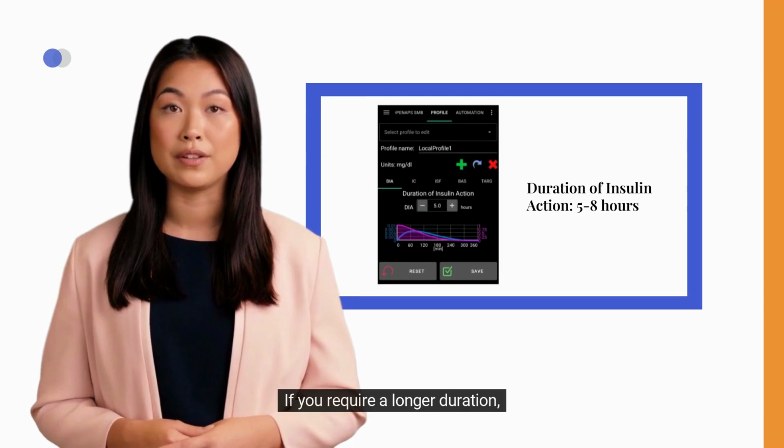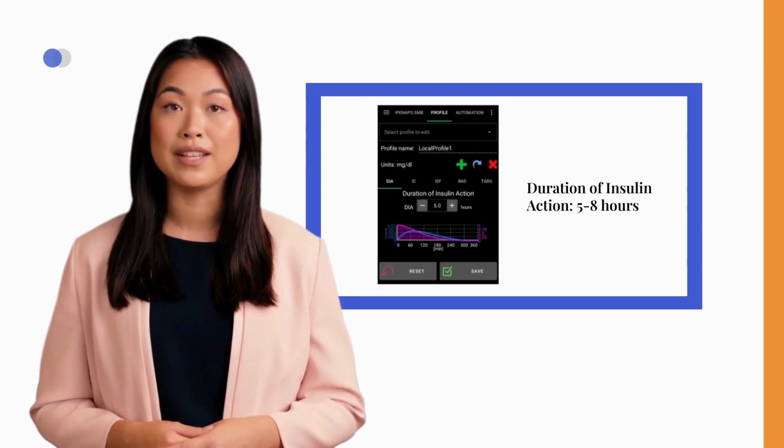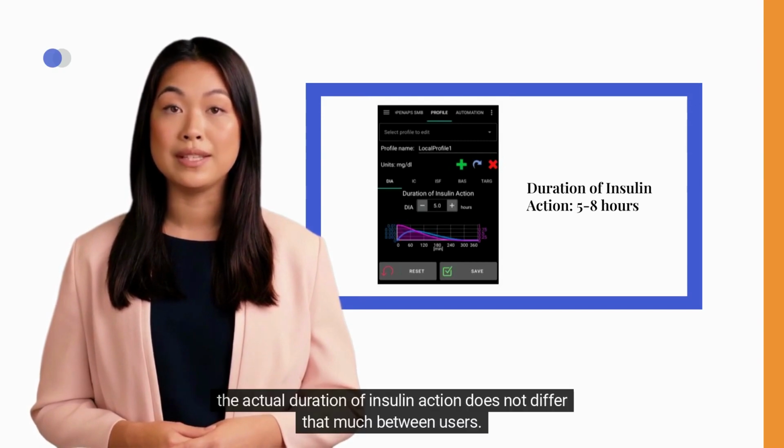If you require a longer duration, check your ISF settings as they might be too aggressive. In general, the actual duration of insulin action does not differ that much between users.